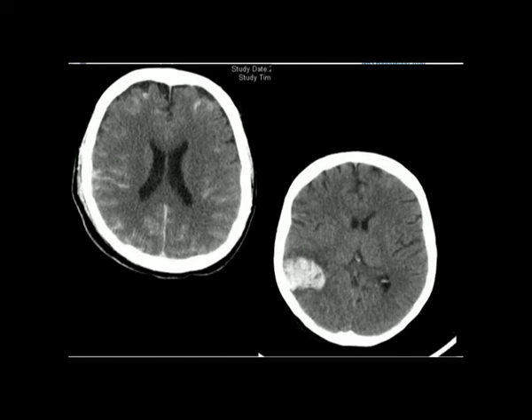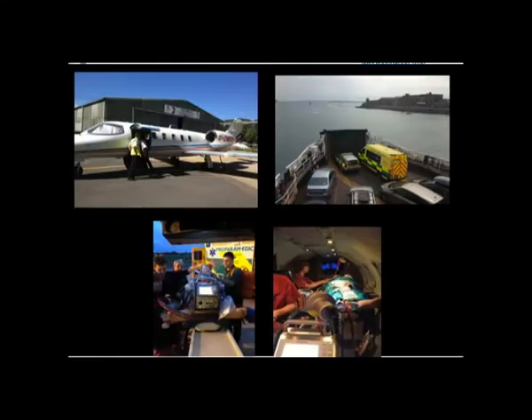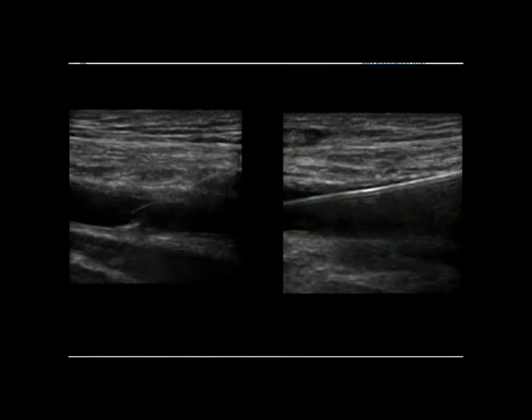The same as intracranial hemorrhage. And these are real CTs in real patients we've had, and they've all been neurologically intact afterwards. 1 in 8 patients on ECMO will have an intracranial hemorrhage at the beginning. Run them without heparin. ECMO gives you advantages in terms of a distributed healthcare system. It allows you to transport the patients.